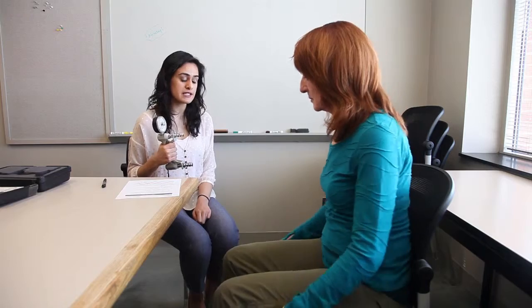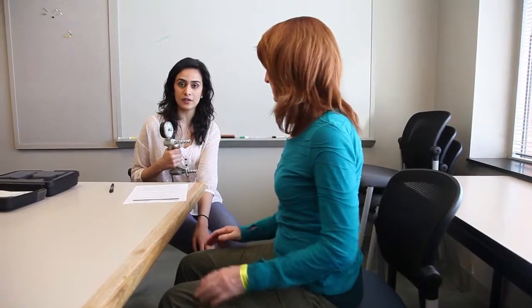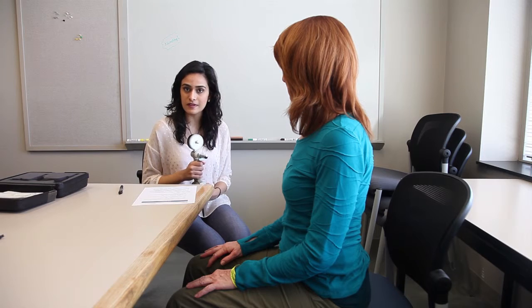We are now going to perform the actual measurement. You will need to have a dynamometer, which is the tool used to perform the grip strength test. To begin, please have your patient move all the way to the edge of their chair and ensure that their feet are completely flat on the ground. We're going to do 3 tests on each hand, so 3 for the right and 3 for the left.